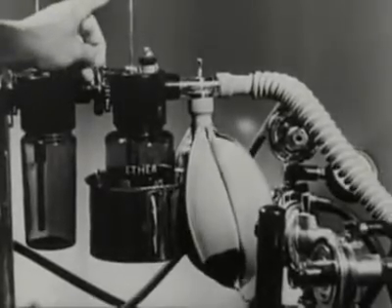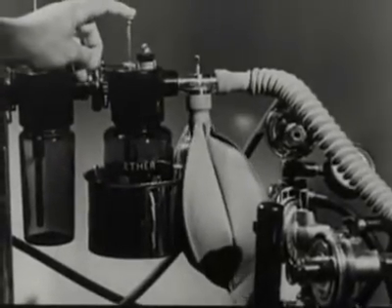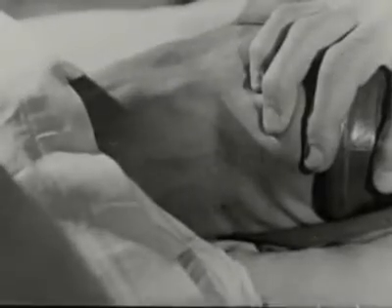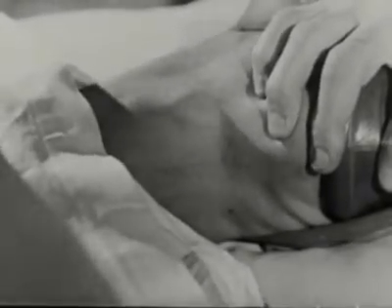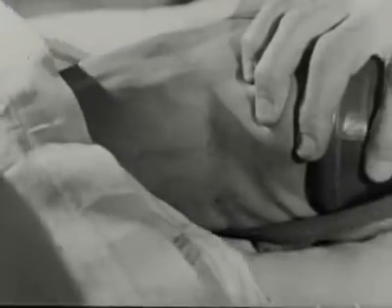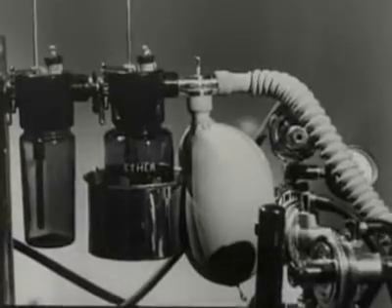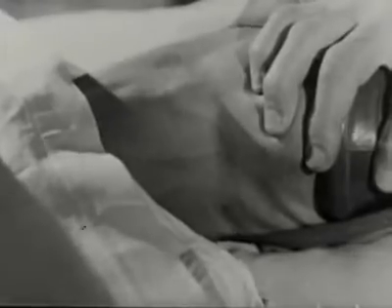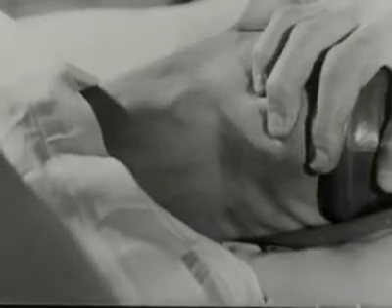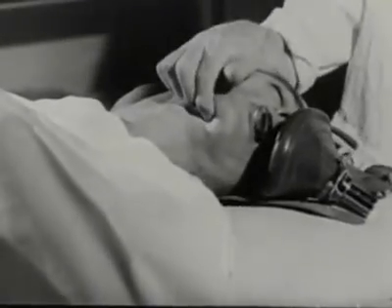For moderate to deep anesthesia, depress the plunger. But remember that there is a sudden increase in ether concentration when the plunger goes below the surface. This may lead to laryngeal spasm. Turn off the ether and wait until the breathing becomes clear. Take the mask away if necessary.